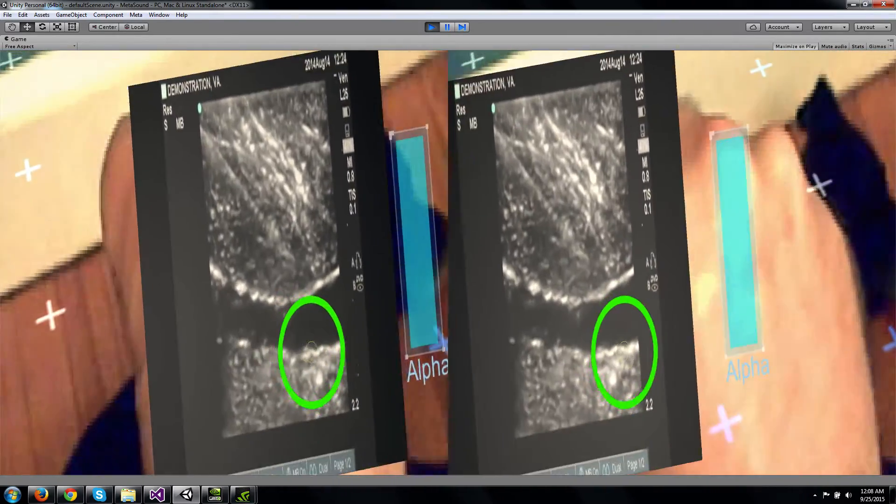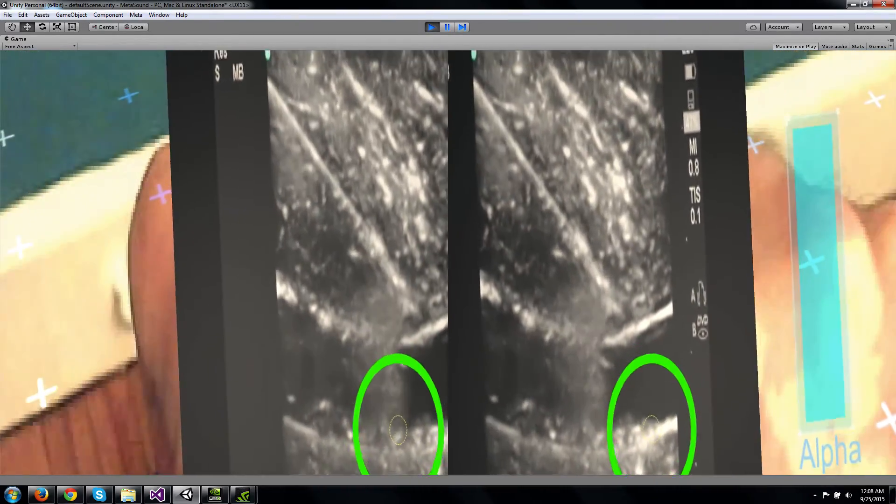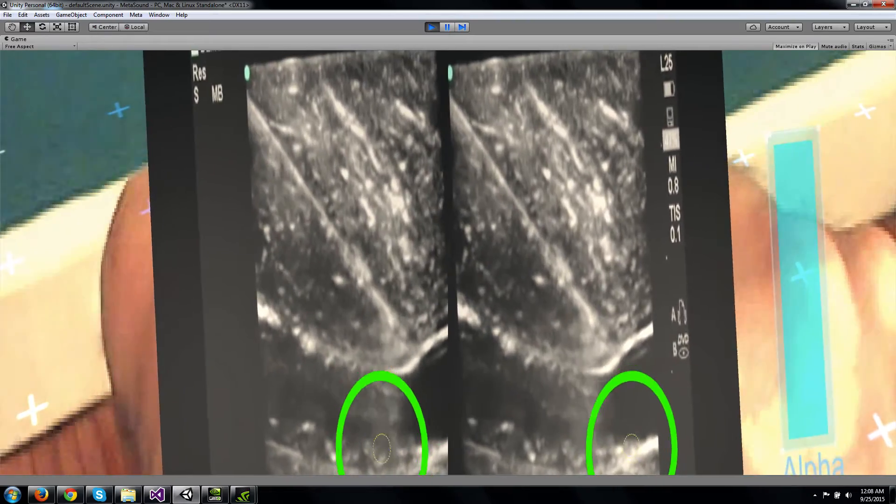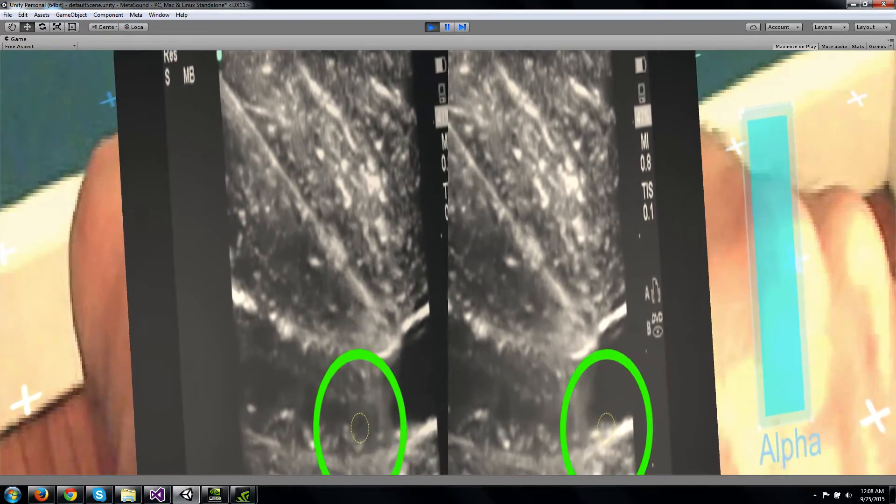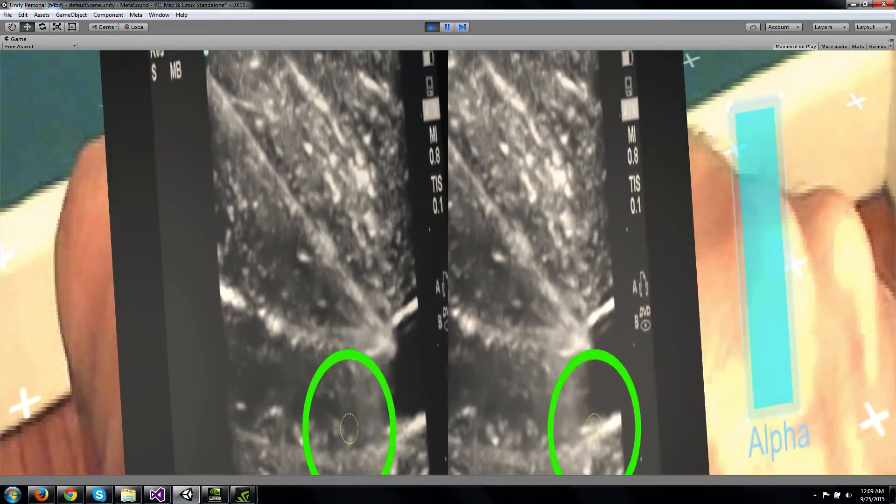I can also just grab it, move a little bit closer to my face if I want to get a little bit of a better view here and see the needle going in.